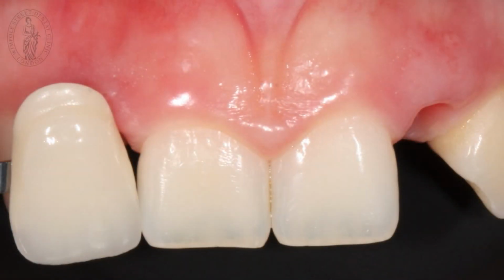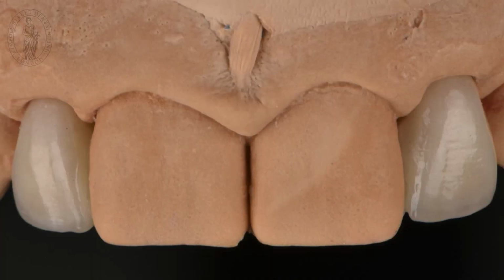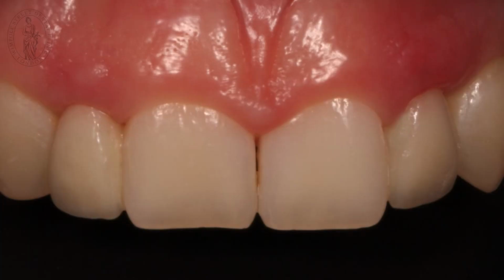So we took the color, prepared the teeth, took the impression, in this case the conventional way, and had then the bridge prepared. And you can see the front teeth are not really prepared. There's just the back of the teeth a tiny bit prepared, so the teeth only lose approximately 10% of their structure. Always check the thickness of the wing. It should have approximately 0.7 millimeters minimum thickness. In this case you can see 1 millimeter thickness, which is fantastic.